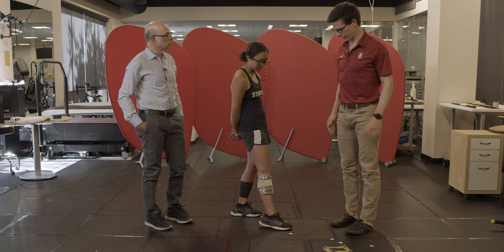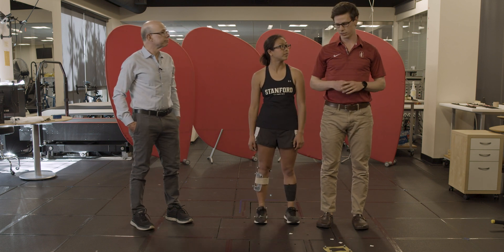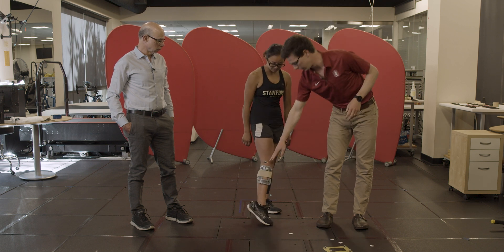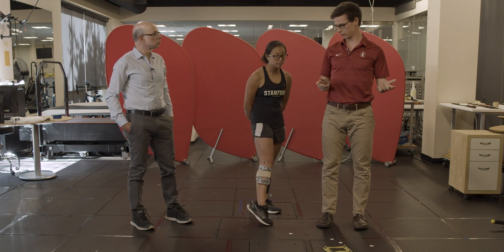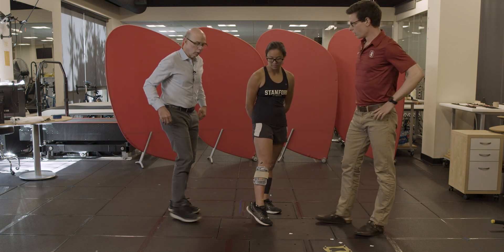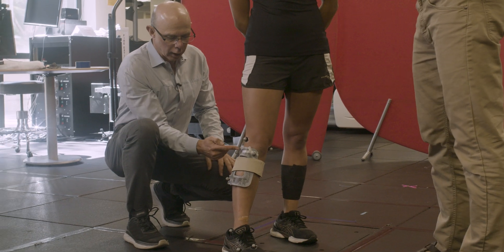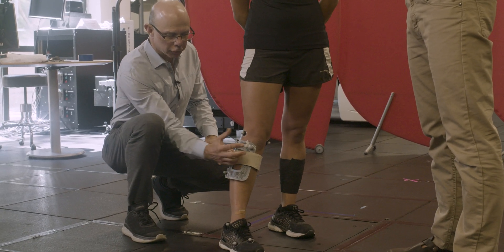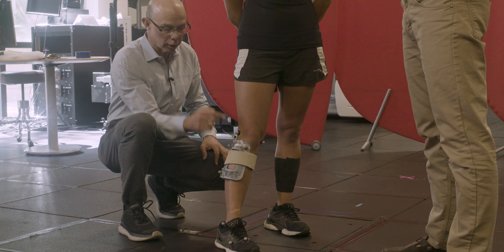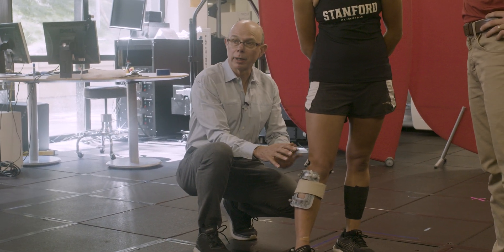Before we start the experiment, we'd have Hannah stand in a static pose and compute the transformation matrix between the anatomical frame on her shank and the tracking frame. Then through all the dynamic trials, we track her tracking reference frame. You can imagine an X, Y, Z reference frame here, and also ones established by these anatomical landmarks — that gives us the ability to transform from one reference frame to another.